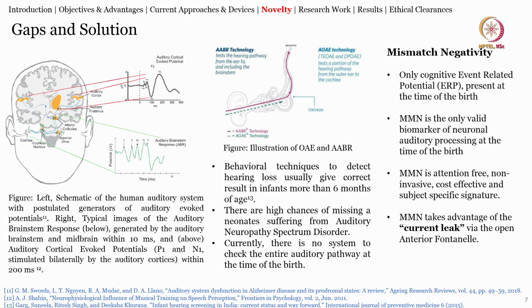We have also seen that in the case of the ABR there are 7 peaks for normal subjects, and if the subject has difficulty in hearing, then it would be different. Particularly peak number 5 is generally of interest in the case of hearing.